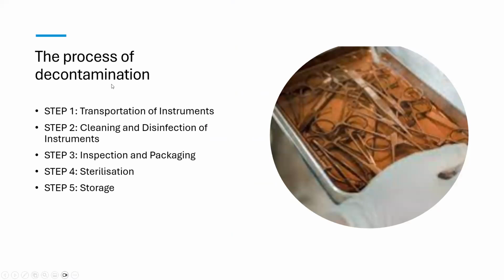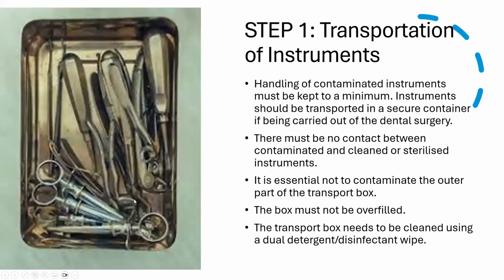The process of decontamination. Step 1, transportation of instruments. Step 2, cleaning and disinfection of the instruments. Step 3, inspection and packaging. Step 4, sterilization. And Step 5, storage.